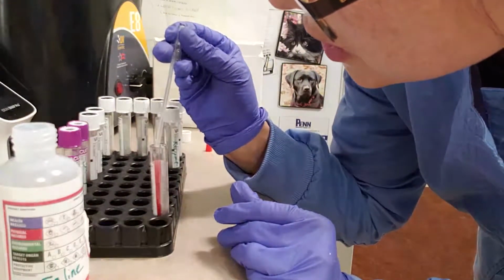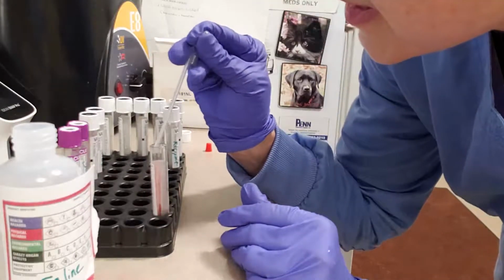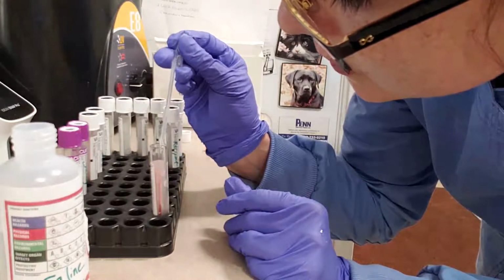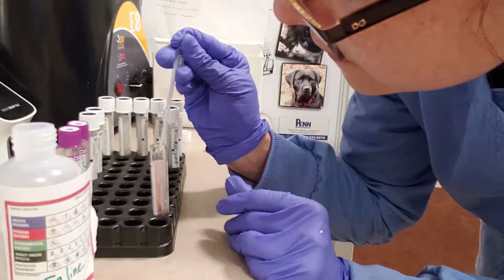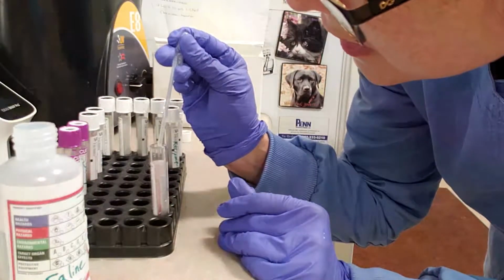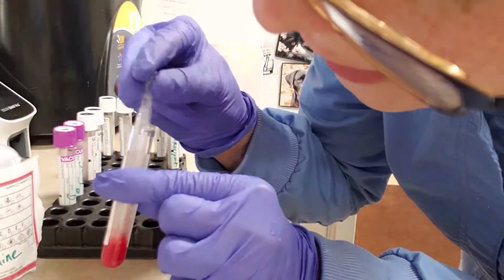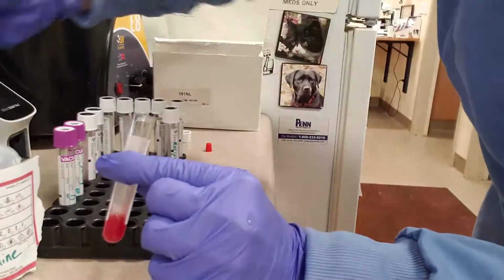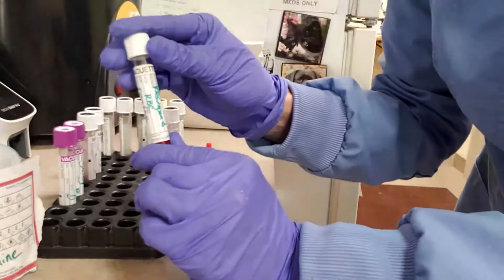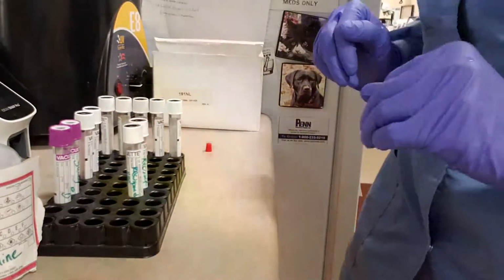So 1, 2, 3, 4, 5, 6, 7, 8, 9, 10, 11, 12, 13, 14, 15, 16, 17, 18, 19, 20. Okay. And now we will gently mix our suspension, and we will put this over here. So now we have our resuspended red blood cell suspension for each of our cross-match recipients.